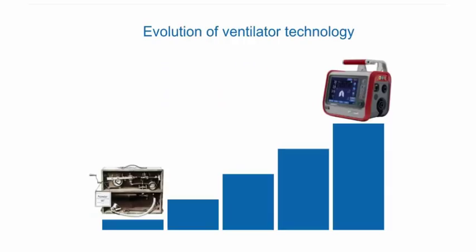At the very beginning, ventilator design was simple and rigid. Ventilators worked well only in a passive physical model. When a ventilated patient breathed actively or his or her clinical condition changed, asynchrony was inevitable. If this occurred, the operator only had 2 options: either to adjust the settings around the clock or to suppress the spontaneous breaths. Neither is a good option. To solve this problem, the ventilator industry constantly introduced new modes, some useful and some less useful. Only a few good ones stand the test of time.